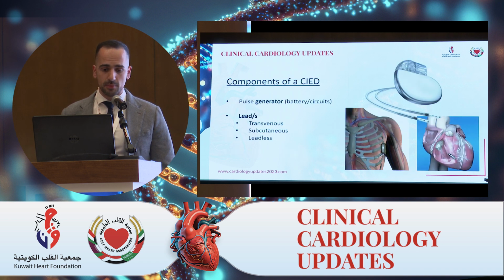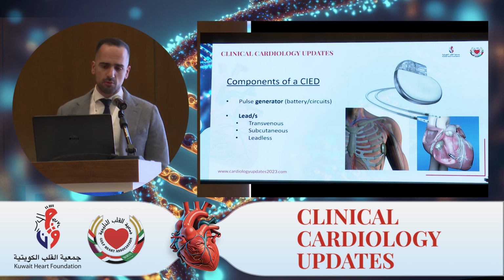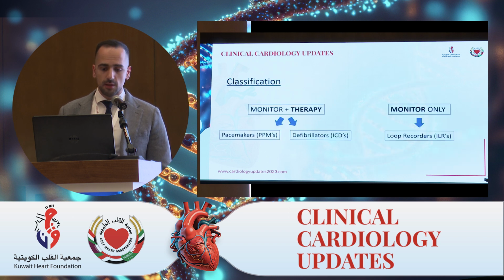The basic components of a CIED are quite simple. You have the generator, which houses the battery, the circuits, everything the device needs to do. And this is connected to the heart via leads. Traditionally, these are transvenous leads, which are inserted transvenously and inserted endocardially. But now we're also starting to see subcutaneous leads, as is the case with subcutaneous defibrillators, as well as completely leadless devices such as the leadless pacemaker, in which everything is housed in a small capsule that is inserted into the right ventricular apex.